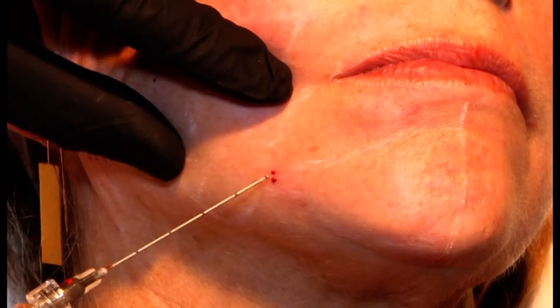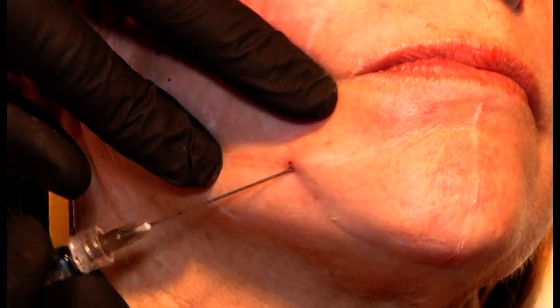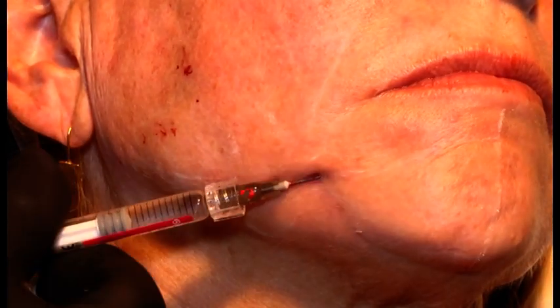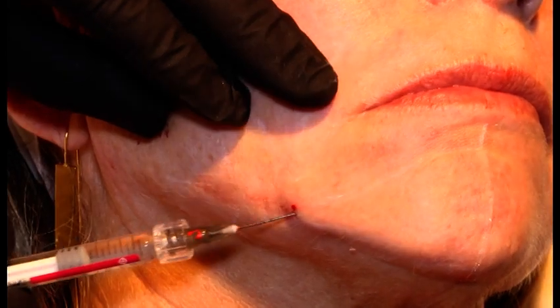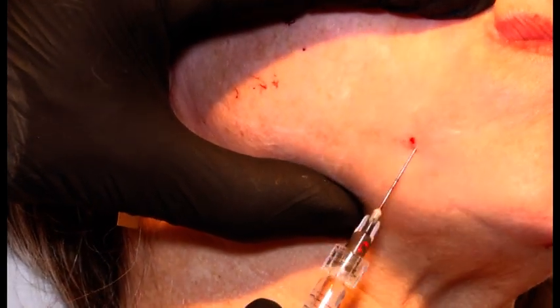So if I stay subcutaneous, I'm in the other anatomical layer, so I don't have much risk of entering into the vessel. So I am able to inject subcutaneously relatively safely. Again, of course, it's small retrograde linear threads, Belotero Intense. I can go up to the oral commissure.